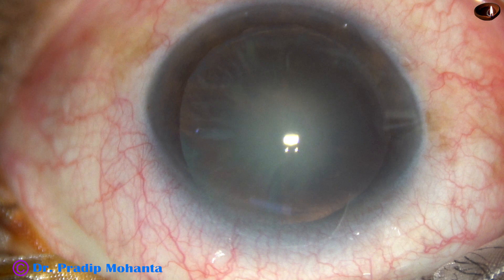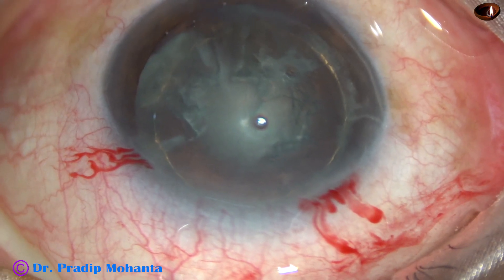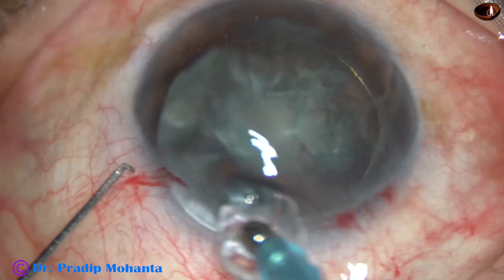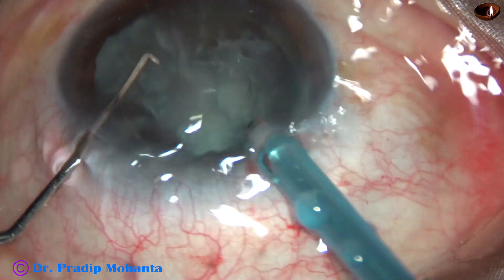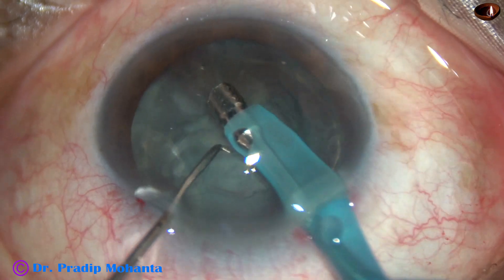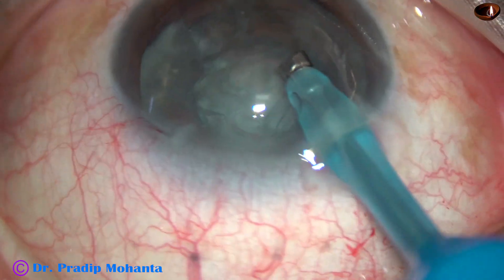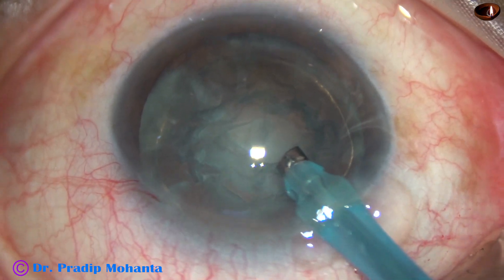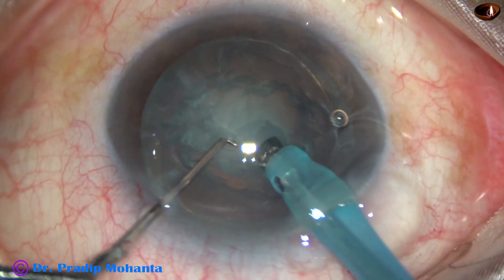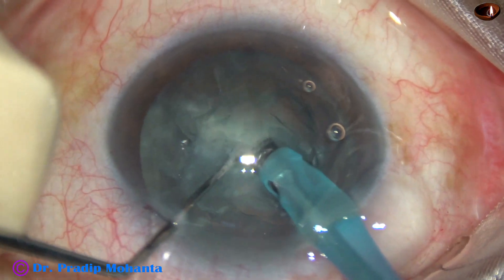This is the second case. Nucleus sclerosis in this case is about grade 2. Hydrodissection has been done after capsulorexis. The tip of the FACO needle is introduced into the anterior chamber and some superficial cortical lens matter is removed. The handpiece is turned, bevel is up, and a very small crater or pit is made just in front of the main incision so that we can support the lens mass. And here it is.